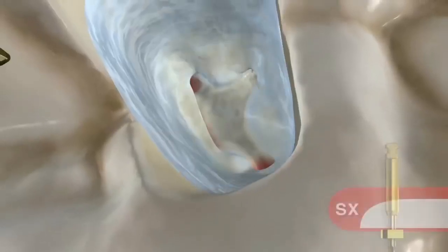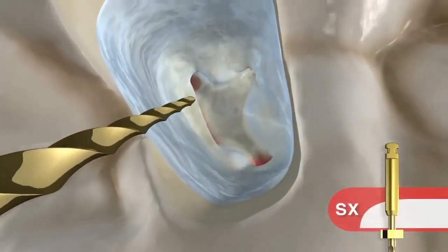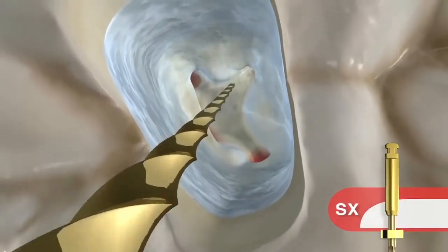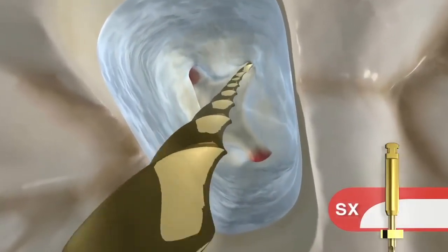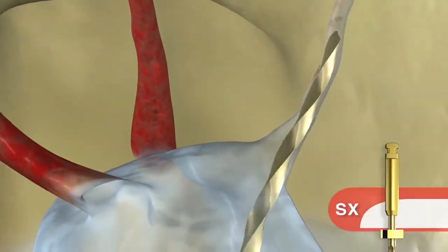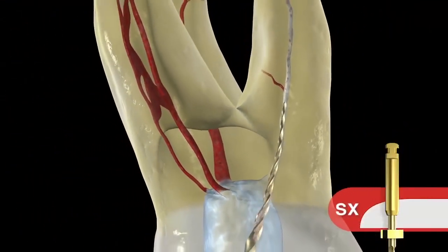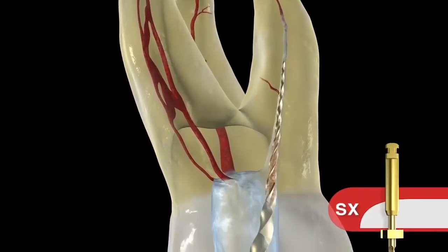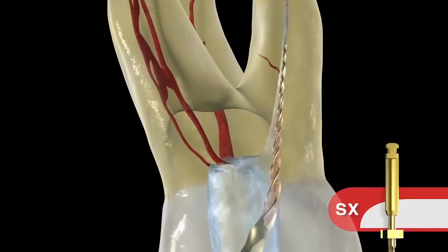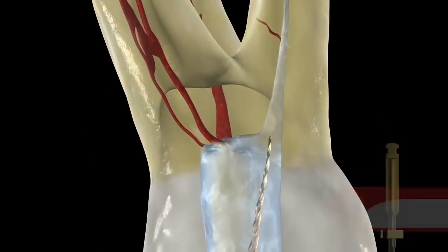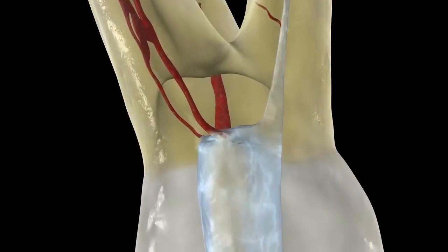Back to the tooth where we had the glide path — with a chamber full of sodium hypochlorite, let's go in with SX. The take-home message is: Shaper X is a big brush. Plant that instrument on the outer wall, away from furcal danger, and brush out on the outstroke. In one or two passes, you can pre-enlarge virtually any canal. This is done very, very quickly and safely, because we had a glide path.